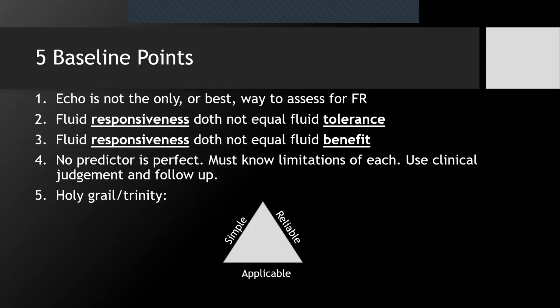And unfortunately, for the most part, the tools that we have available usually can accomplish 2 out of 3, but not all, maybe with an asterisk, which we'll get to. But most tools that I'm going to show you can't do all 3. We don't really have a holy grail yet, maybe.